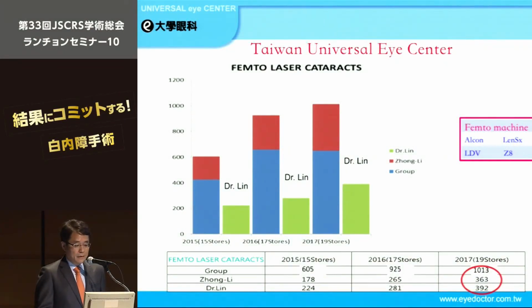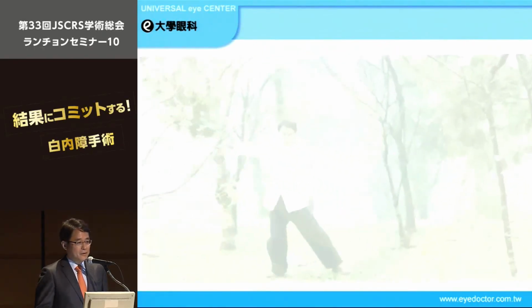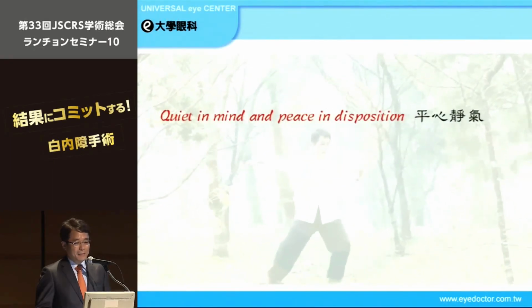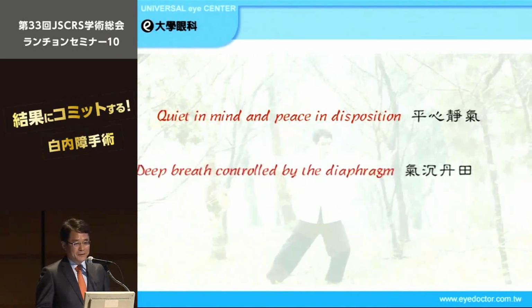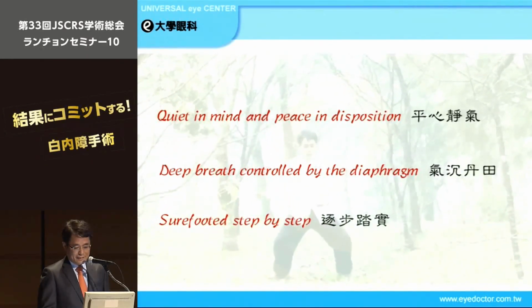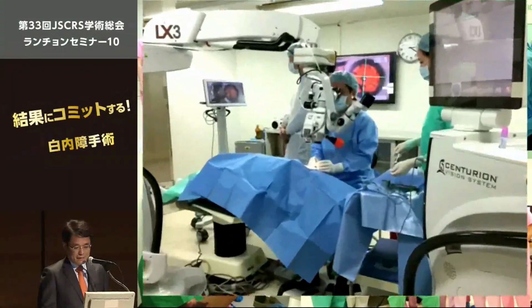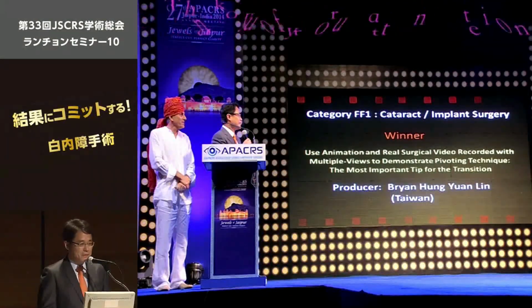About femtosecond laser cataract, we can see in 2017, our group performed more than 1,000 cases, including almost 400 cases I performed. Additionally, this video shows my personal tips when I perform a complicated cataract surgery. And thank you for your attention.